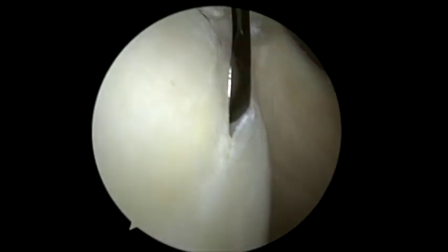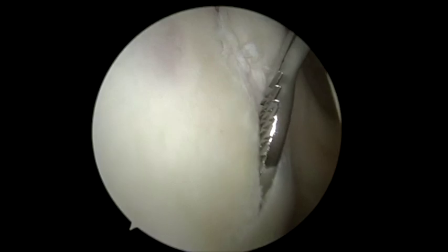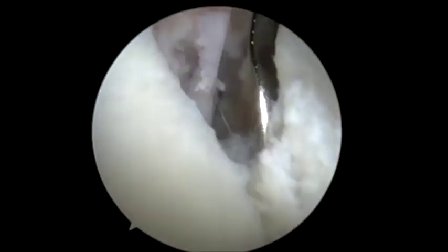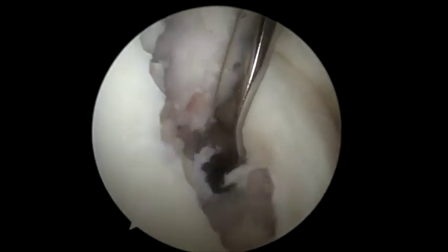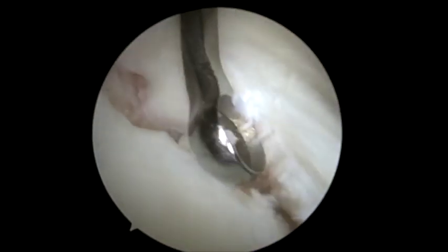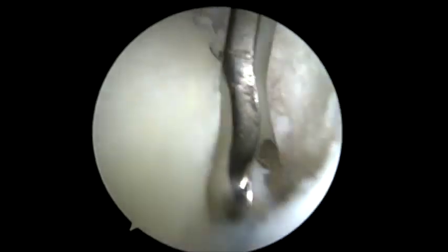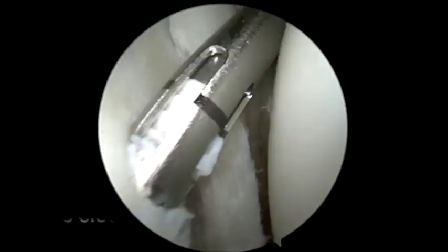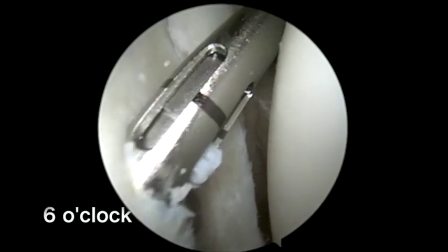First, the capsulolabral complex is adequately detached and mobilized from the glenoid neck, revealing the subscapularis muscle. To promote tissue healing, a small amount of the articular cartilage is removed from the anteroinferior glenoid face. The first anchor is inserted at the 6 o'clock position.